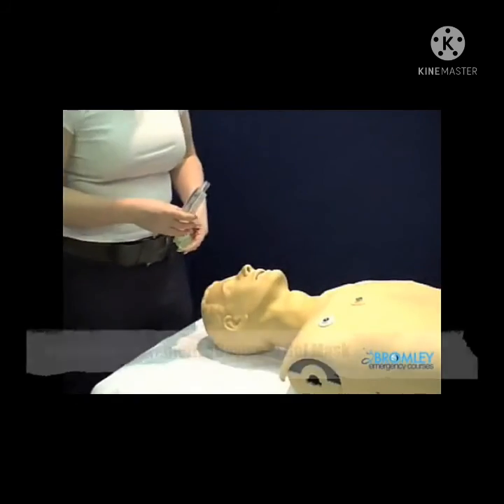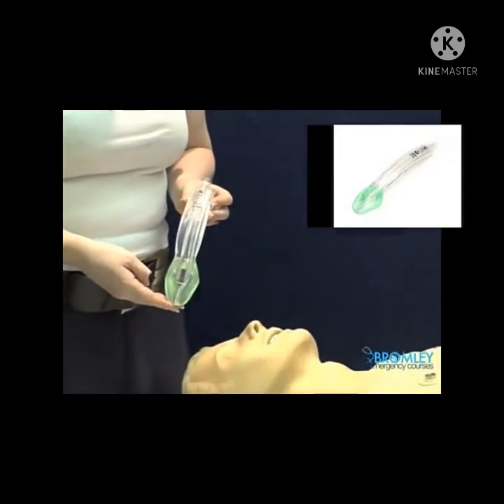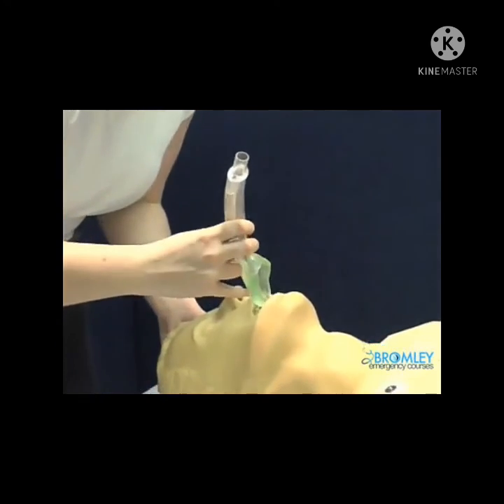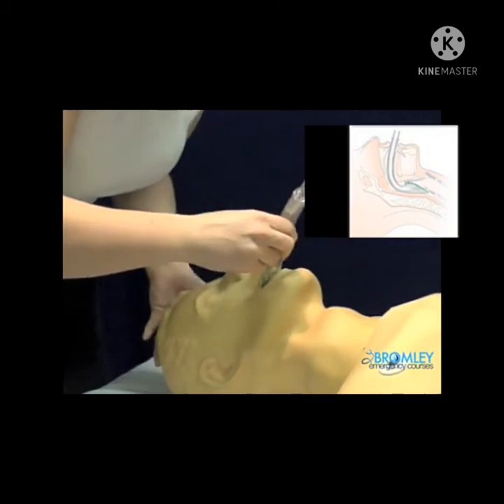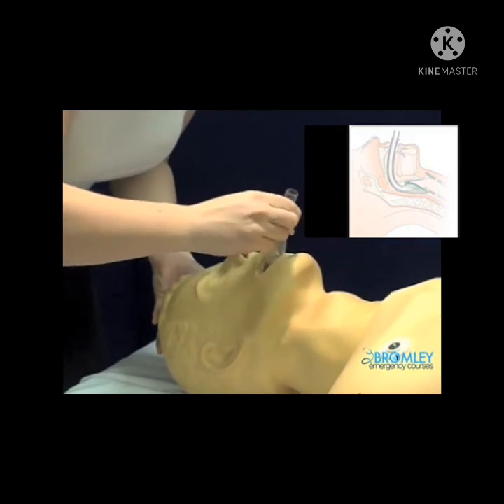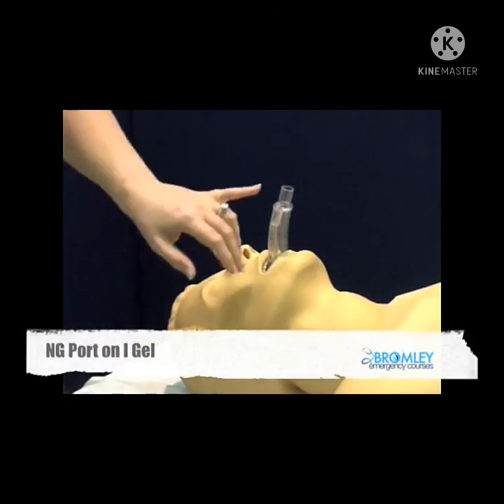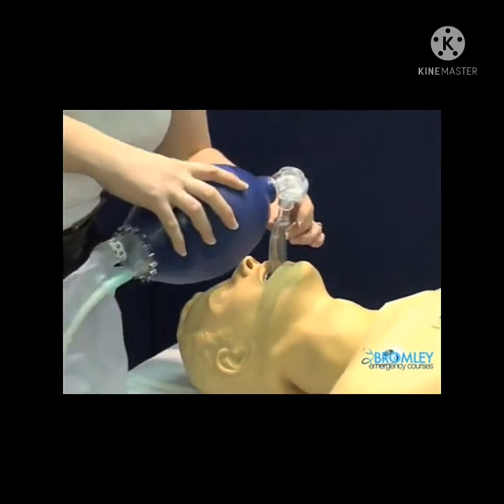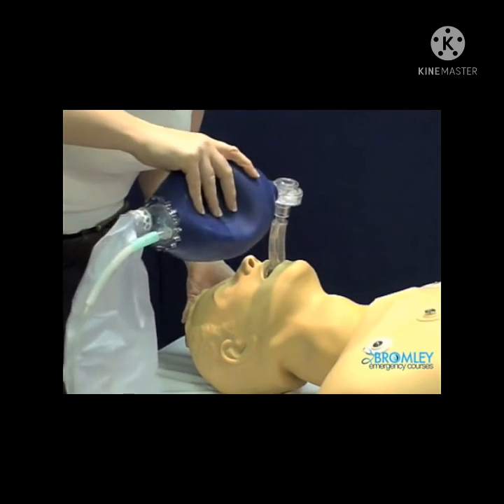An alternative to a laryngeal mask is an i-gel, which is inserted in a very similar way. You don't need to inflate a cuff in the i-gel, and one of the benefits is that it has a port at the side to allow the passage of an NG tube. And again, you can attach the bag valve mask and ventilate.